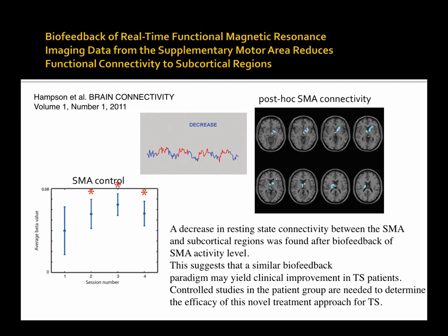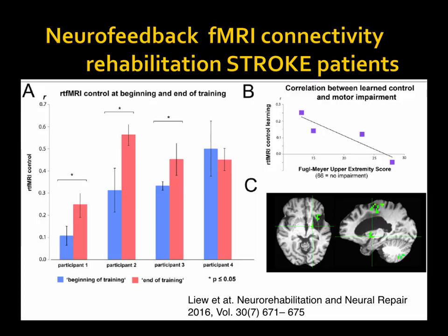And that's the reason why I was mentioning that in most of the studies now when we do neurofeedback, pretty much everybody is collecting some resting state before and after, because it will let us know not only the transfer, but whether we are modifying the networks in the brain beyond what the task per se would be doing.